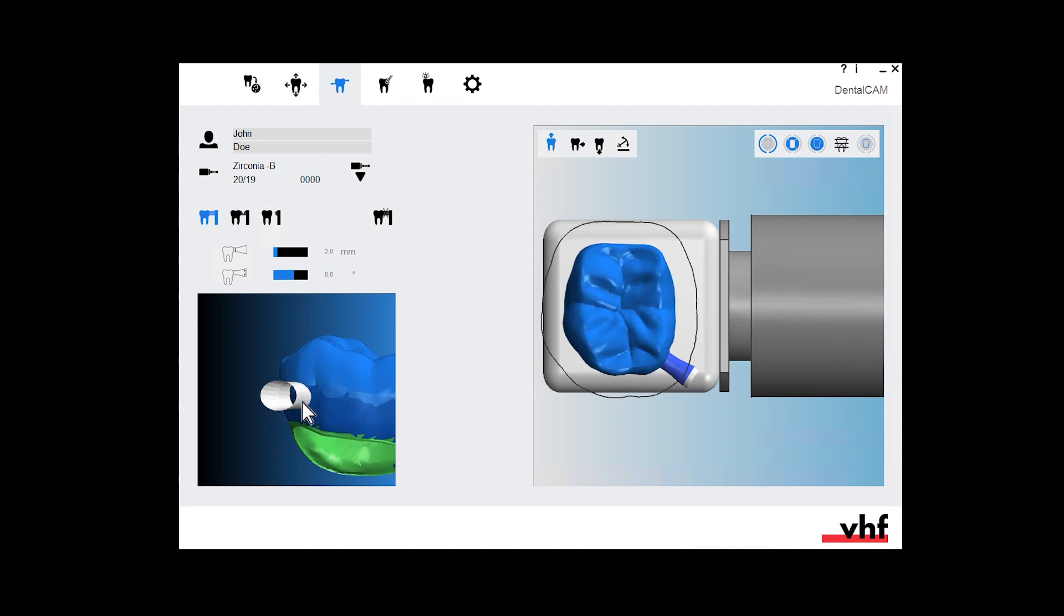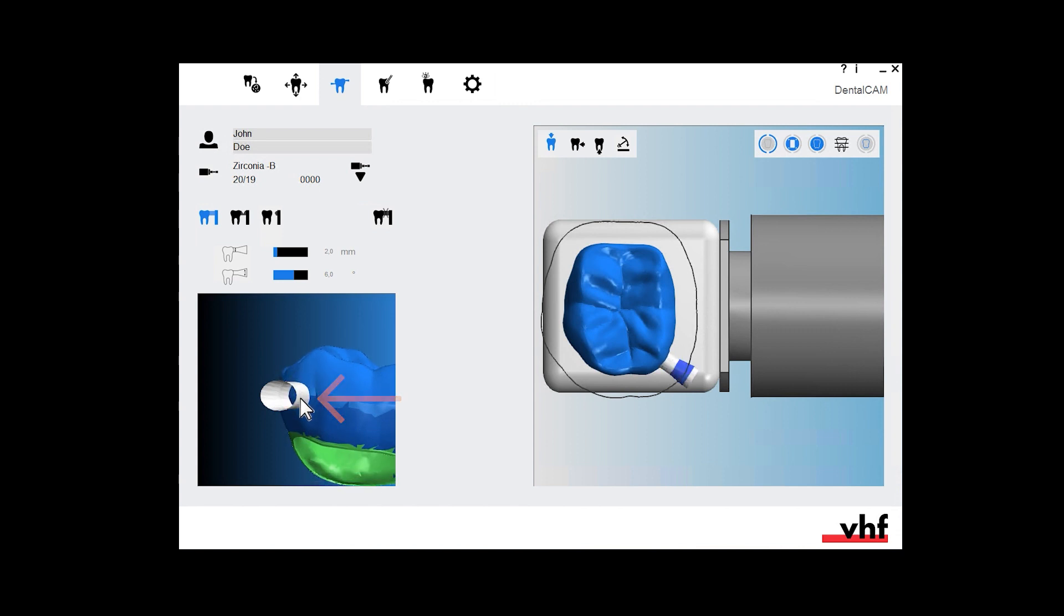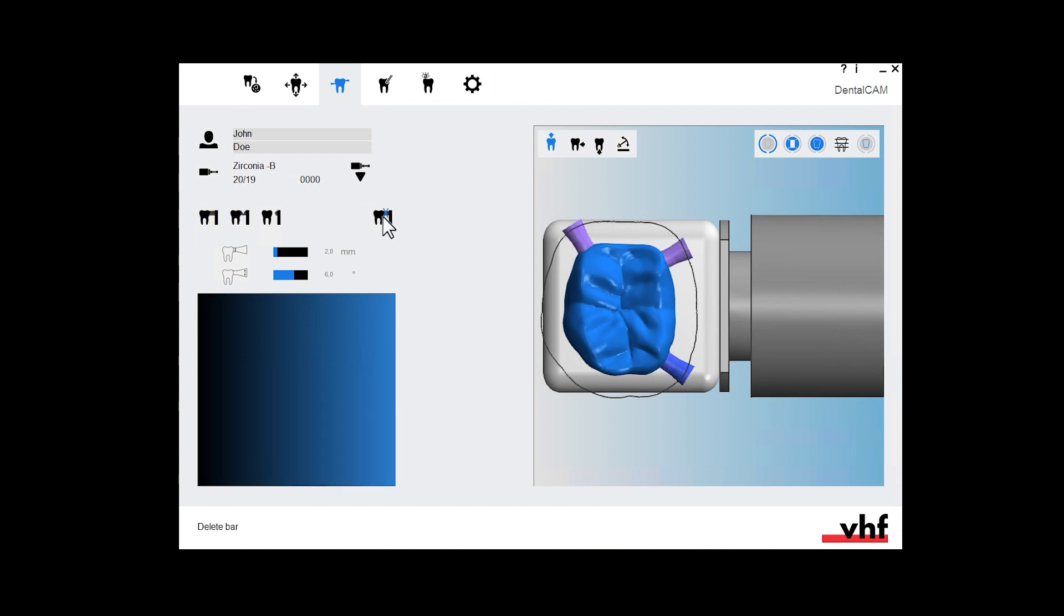If possible, place bars exactly on the equator line to avoid an undercut. If the equator is close to the preparation line, place the bar approximately 1mm above the equator. If you want to remove a bar, select the icon for removing bars and left click on the desired bar. For a single crown, we recommend using 3 bars.